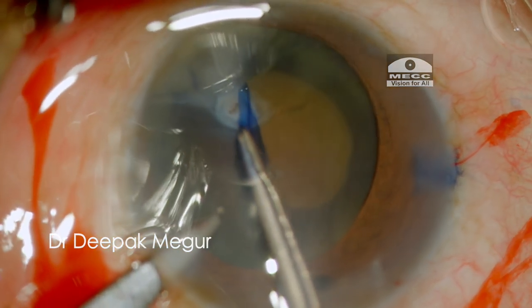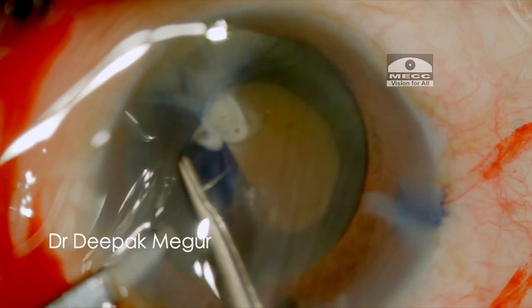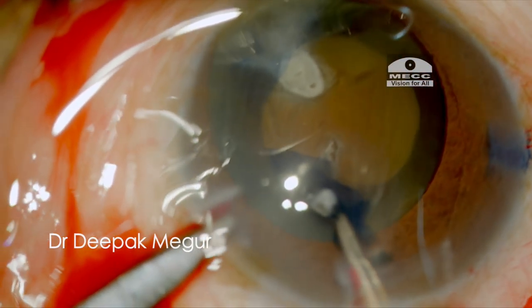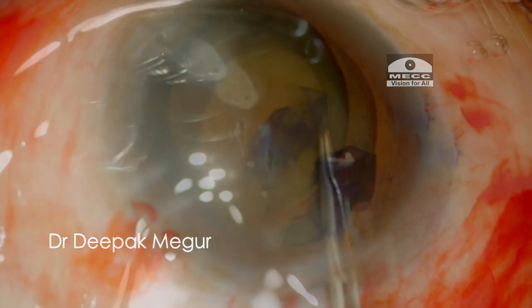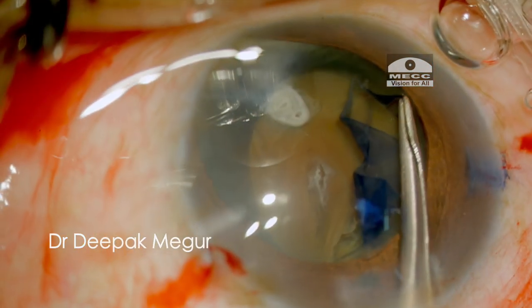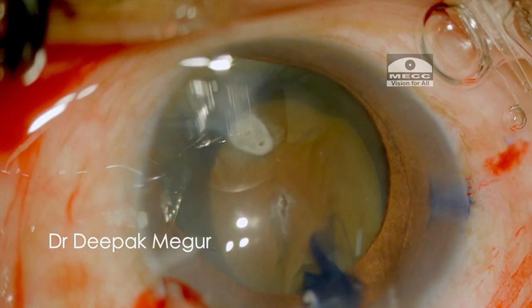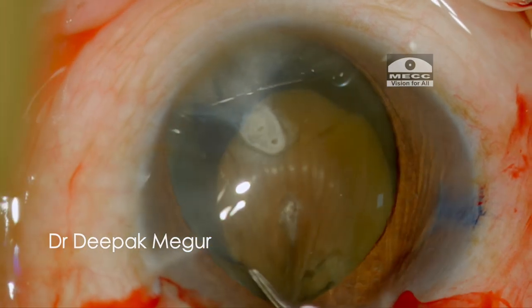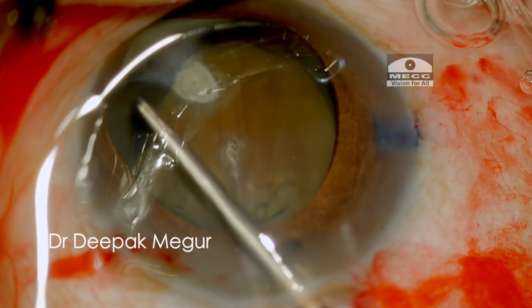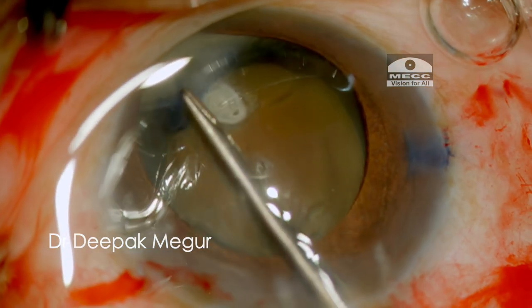As soon as I reach the area of the calcified speck, I try to move around it. Luckily the capsule behaved quite well in this quadrant. The CCC is completed and looks alright, but I thought I'd like to have a slightly bigger one, especially in the inferior quadrant. So I enlarge the capsular opening using scissors and forceps, and eventually I have a decent-sized rhexis which would make my life easier with the subsequent steps.